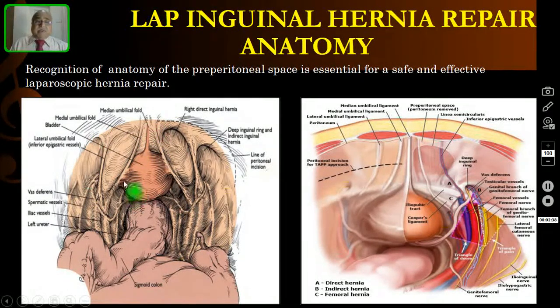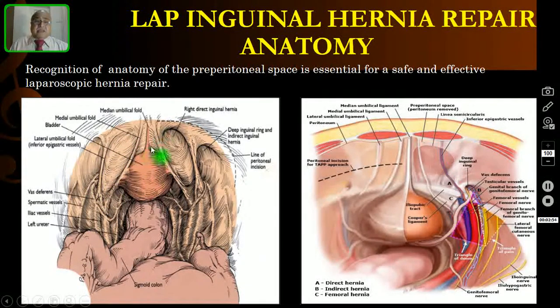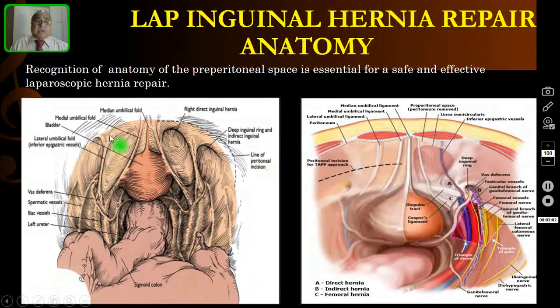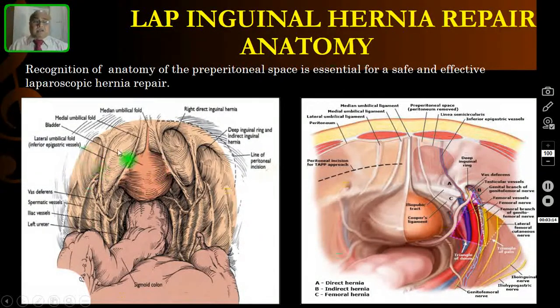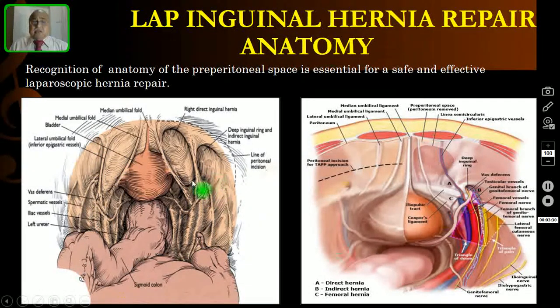The medial umbilical ligaments are remnants of the umbilical arteries. You also see the lateral umbilical ligament on each side, which is the peritoneal fold over the inferior epigastric artery. You must also recognize three fossae: the supravesical fossa, the medial inguinal fossa — which is Hesselbach's triangle through which the direct hernia protrudes — and the lateral inguinal pouch, where you can see the internal ring opening through which the indirect hernia occurs.